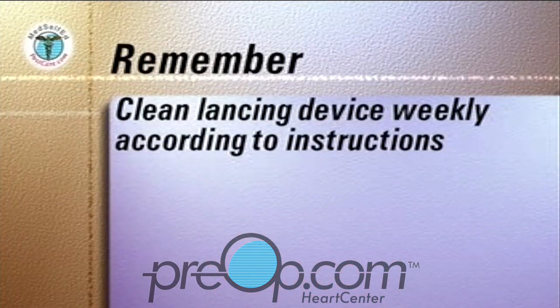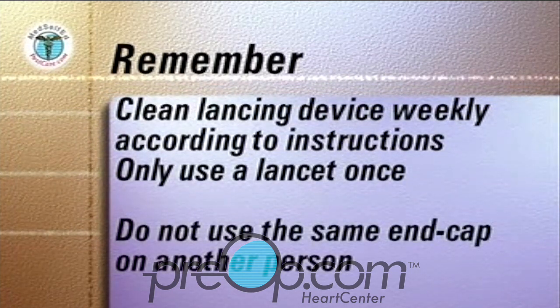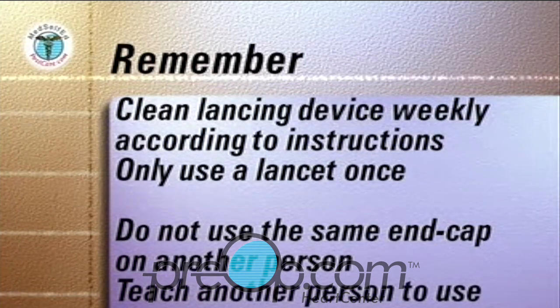Clean the lancing device weekly, according to the manufacturer's instructions. Only use a lancet once. Do not use the same end cap on another person. Teach another person to use the whole system so that you have a backup when you need assistance.